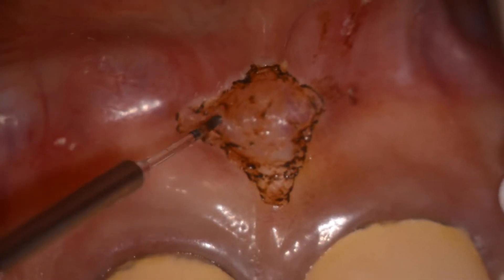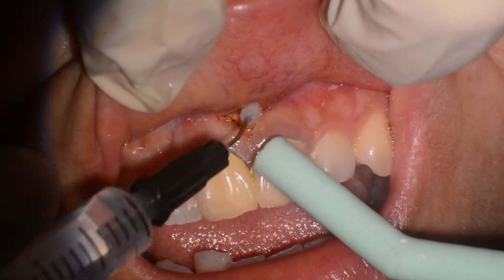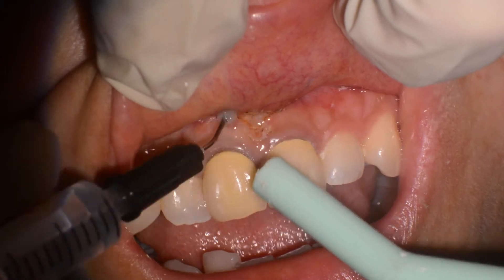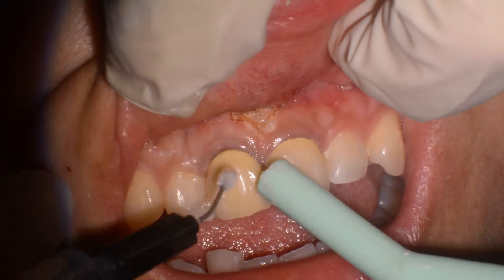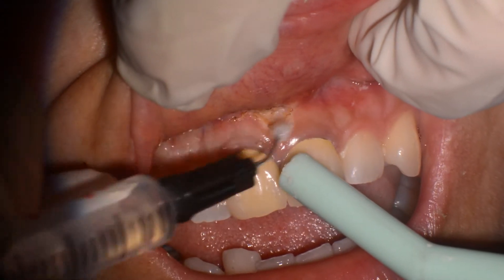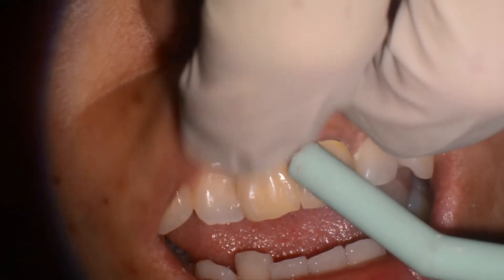I usually like to touch first and third base in the diamond to open it up. What we're doing now is using an ultra-dense syringe with some hydrogen peroxide to clean any charring off. Patients don't want to see charred tissue, so it's nice to just brush a very low concentration hydrogen peroxide — the kind you'd find in the drugstore — on the soft tissue, which will remove any of the charred remains.